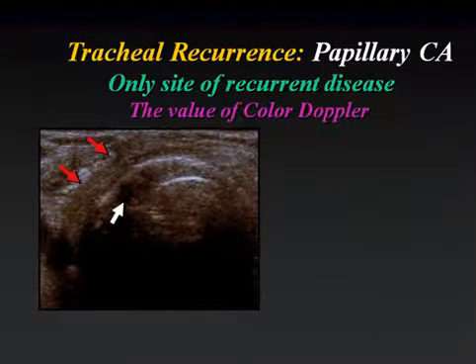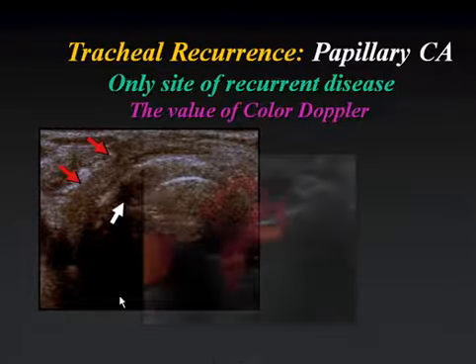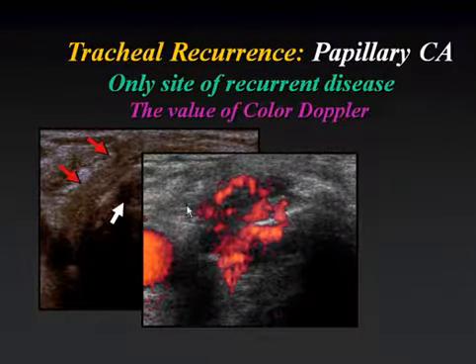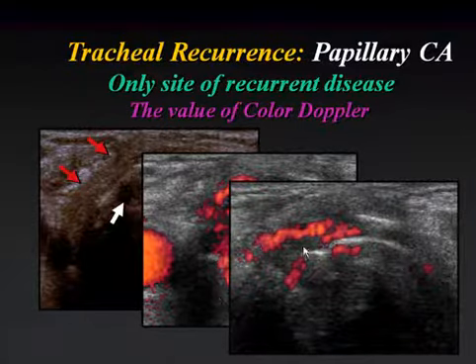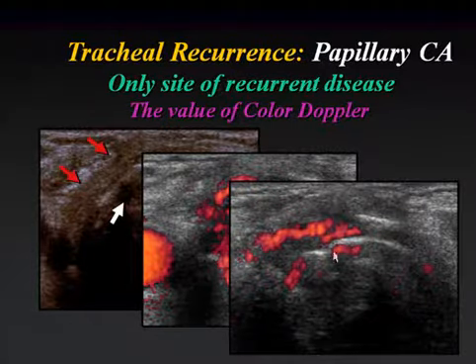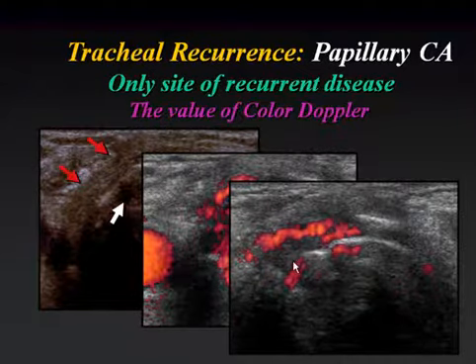Color can be very helpful in looking for a variety of thyroid bed recurrences. And here's an example of very subtle increased thickening of the soft tissues around the trachea. We can see subtle widening of the trachea here. And with increased flow, we can see that there is a more clearly evident hypoechoic soft tissue mass that is really richly vascularized. And this is an extensive recurrence that's invading the trachea. And the hallmark is hypoechoic tissue that's richly vascularized.